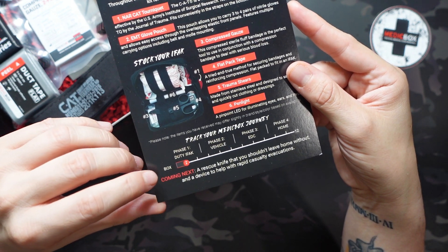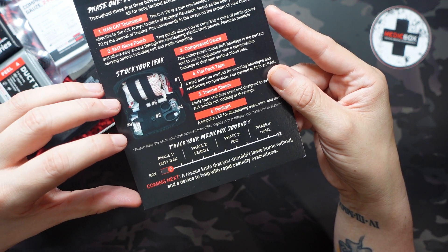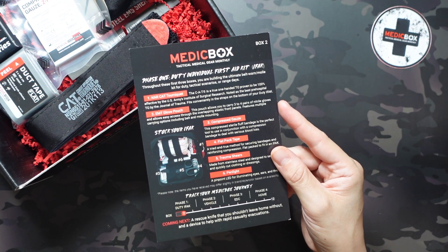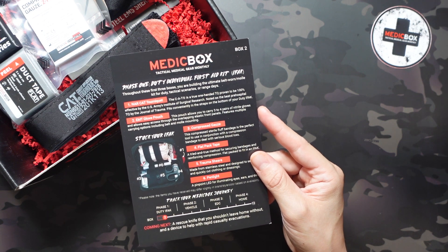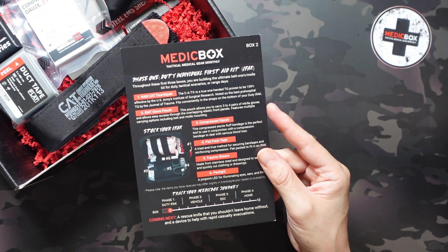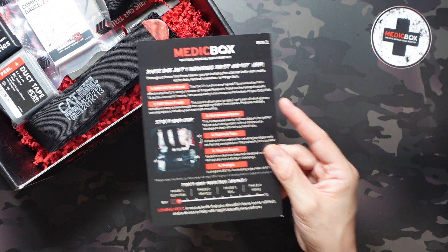It also gives you a little preview of what's coming up next. Next month you can expect a rescue knife that you shouldn't leave home without and a device to help with rapid casualty evacuations. One thing notably missing on here are prices, but a lot of this stuff is name brand and recognizable — you can find and price it yourself. You should come out ahead with the subscription.